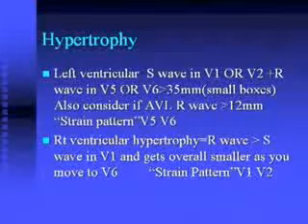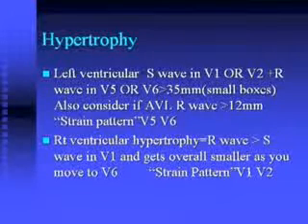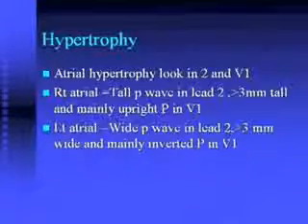Also notice the very small word "or." When it says you can pick lead V1 or V2, make sure you don't pick them both and add them together. And also atrial hypertrophy, which is also very busy.